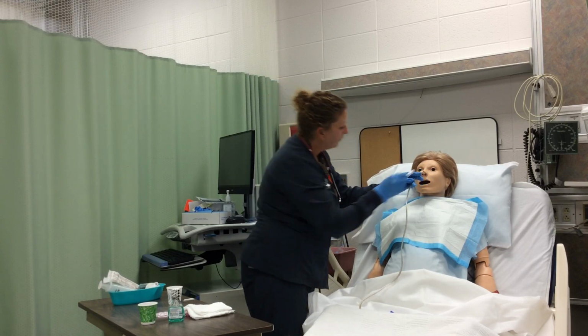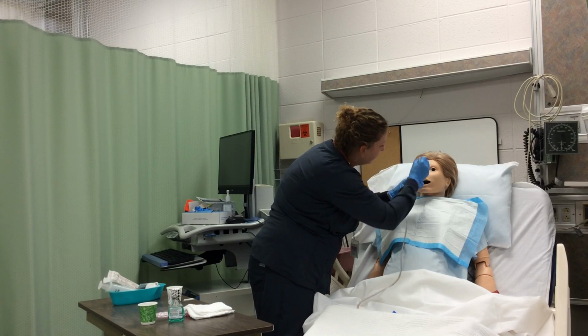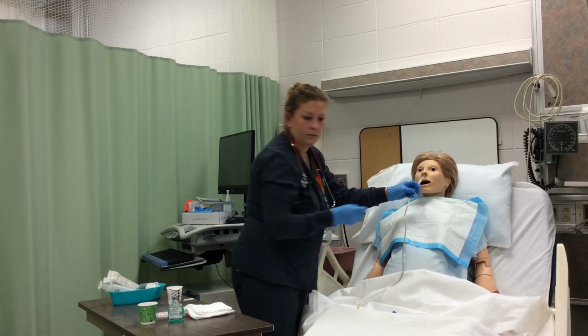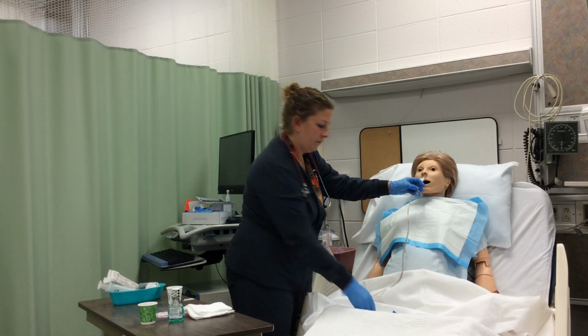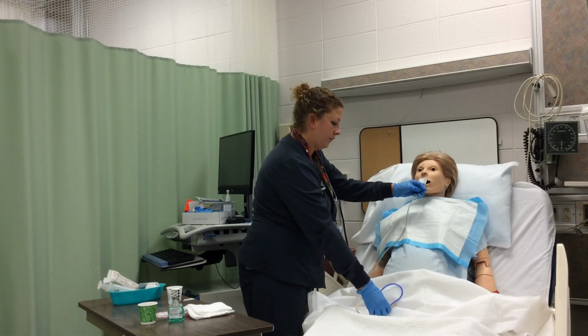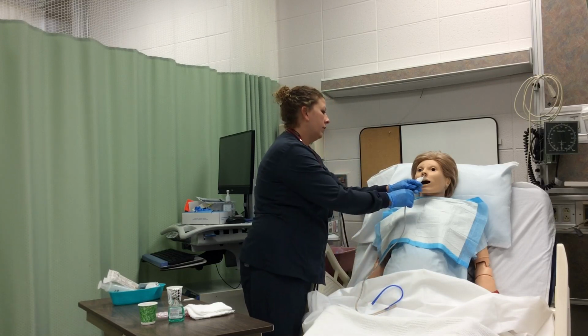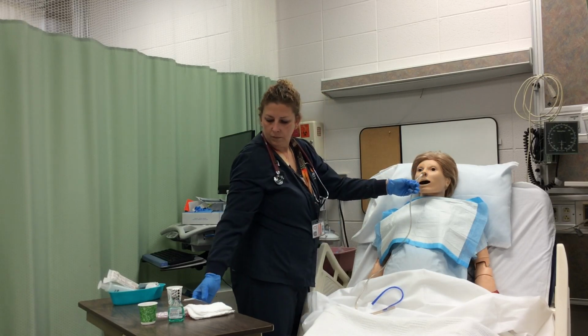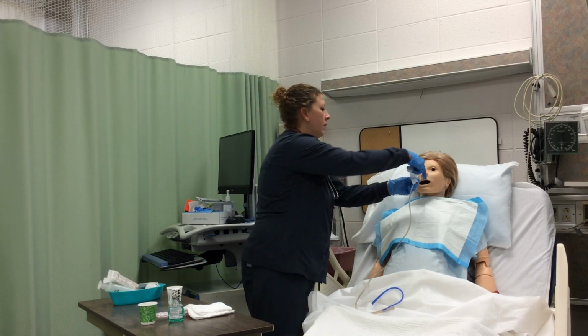When the tube is approximately 25 to 30 centimeters or 10 to 12 inches, assess for air coming out of the tubing. If the tube entered the trachea instead of the esophagus, air exchange may be heard. If air is present, withdraw the tube and start again. If there is no air, continue to advance the tube to the distance marker.